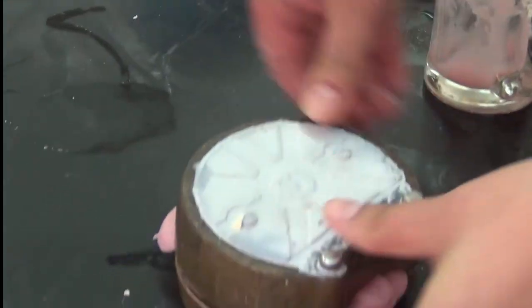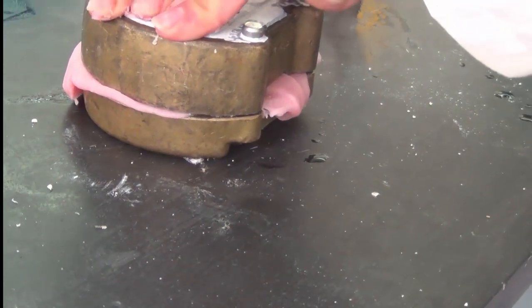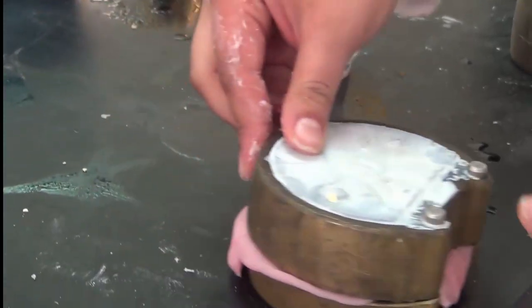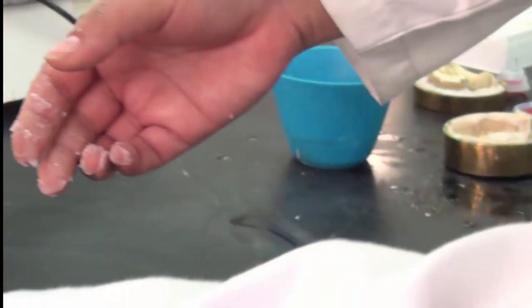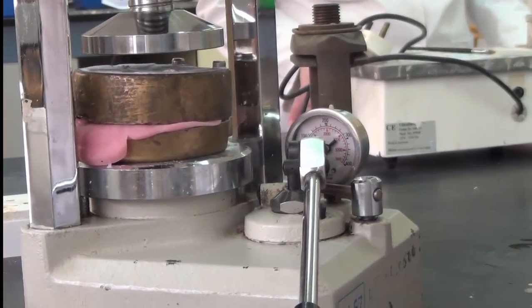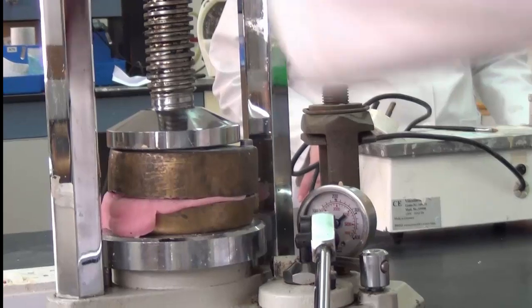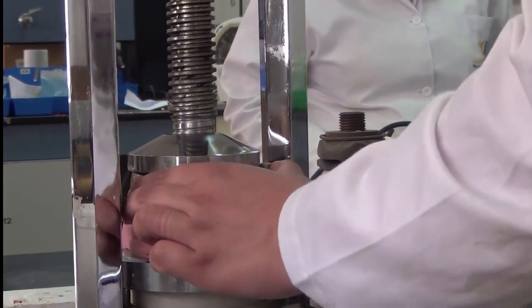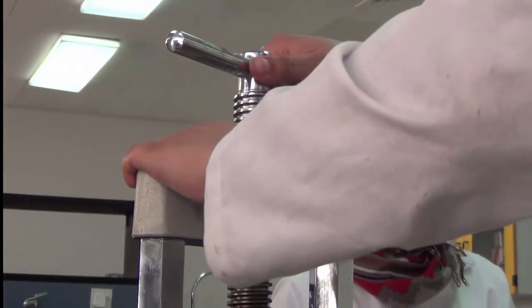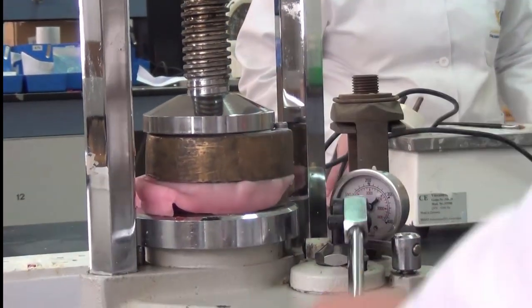Okay, look at the acrylic going out of the sides. The excess acrylic is going out of the sides. Okay, this is packing. This is manual packing, but actually we don't suffice ourselves with this. We put it on the press. So we lower the upper part of the press. It's called a hydraulic press. So manually we put the screw of the upper member of the press. We keep squeezing it until the handle no longer rotates as much as possible. And then we continue adding the pressure from the press itself.